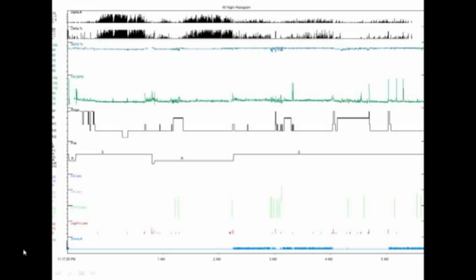If you look down at their sleep study, in the blue, they're having normal oxygenation. Their sleep state is very typical for fibromyalgia because they do not get into that deep sleep at all, just one little bit before 1 a.m., and the rest of it is light sleep and REM sleep. And they don't really have much in the way of obstructive apnea or leg movements. But again, if we look at the top two lines, the pathology in this particular case is very, very clear. Next slide, please.